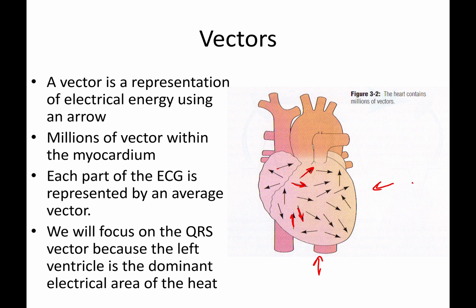So your normal patient should have a general vector in this direction towards that large left ventricle in general. We'll go into more of that later.